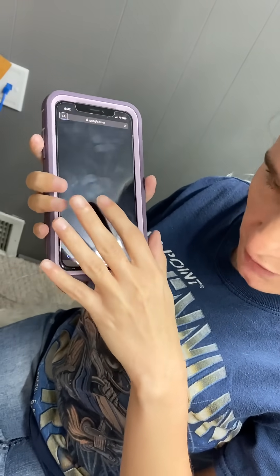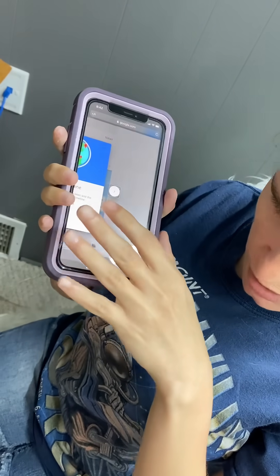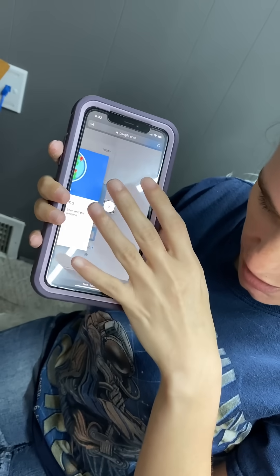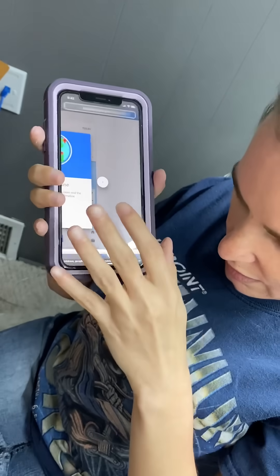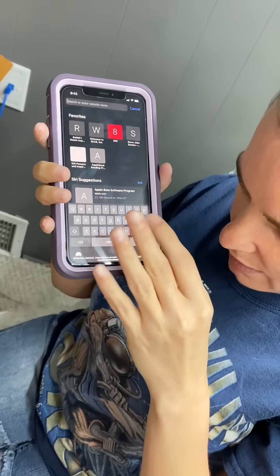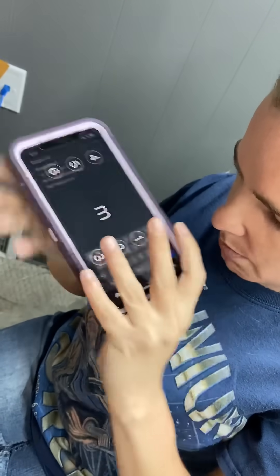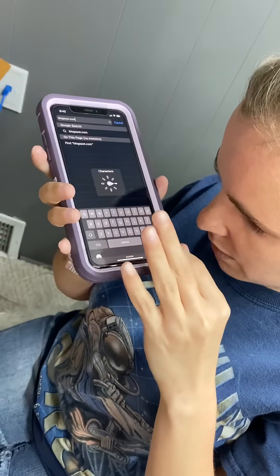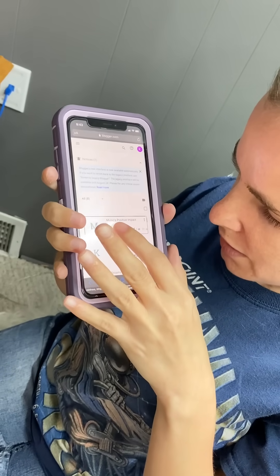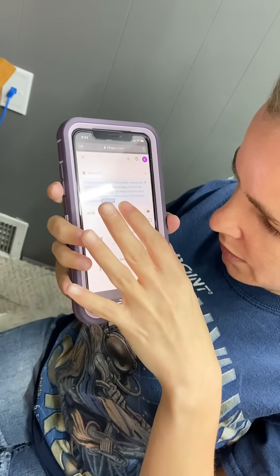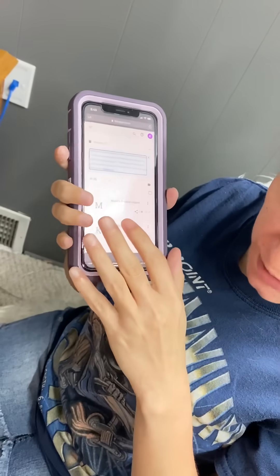So basically, it just reads whatever is on my screen, and then I can interact with it and double tap or triple tap or scroll using three fingers up and down. So yeah, that's basically how I would use my iPhone. Thank you.